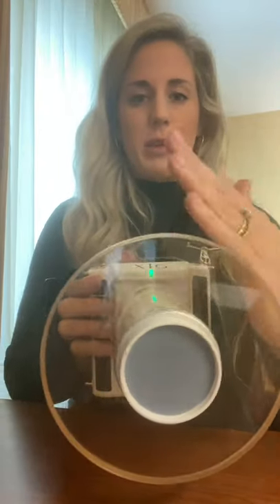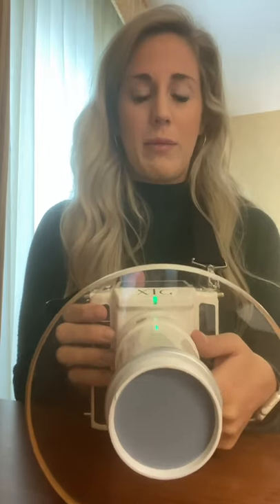When you take an x-ray you do want to stay as close to directly behind this shield as you can. This shield is going to be protecting you from getting backscatter radiation if you stand directly behind it. If that means you have to have your patient move their head or face you or turn towards you to make it safe for you, then that's okay. We just want the operator to stay as safe as possible.